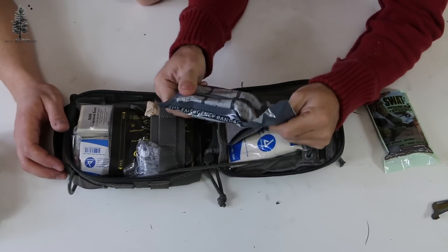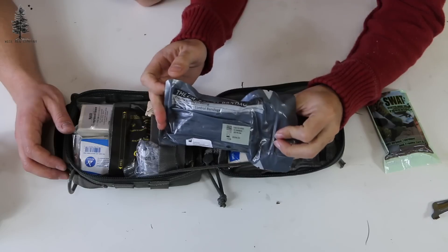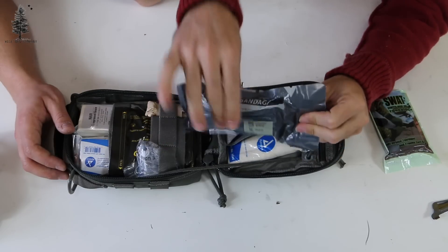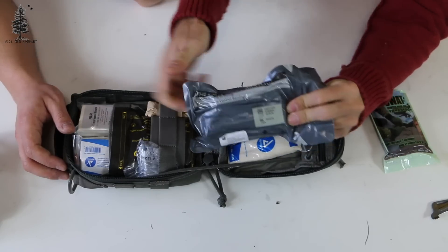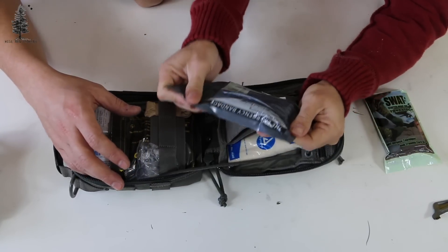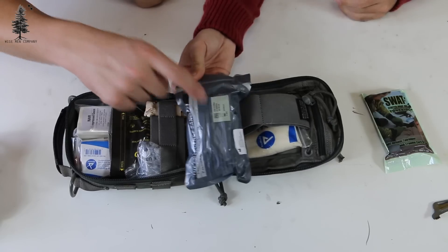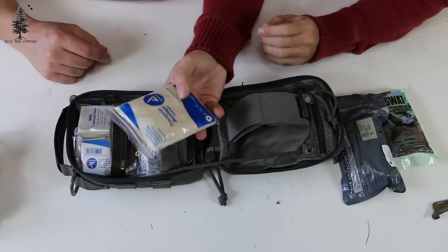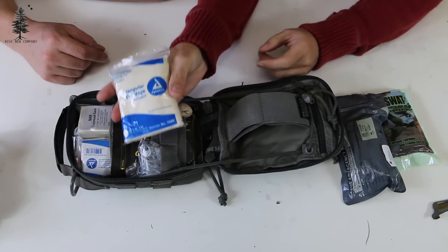Next here you have your Israeli bandage — again a pressure bandage. Highly recommend these; these are great. You pack this on the wound, after you've packed the wound you put this on, wrap it around, strap it down. This is the four-inch version, so that's the smaller one. Also here is a triangular bandage — this is to make slings, things along those lines. Handy to have.